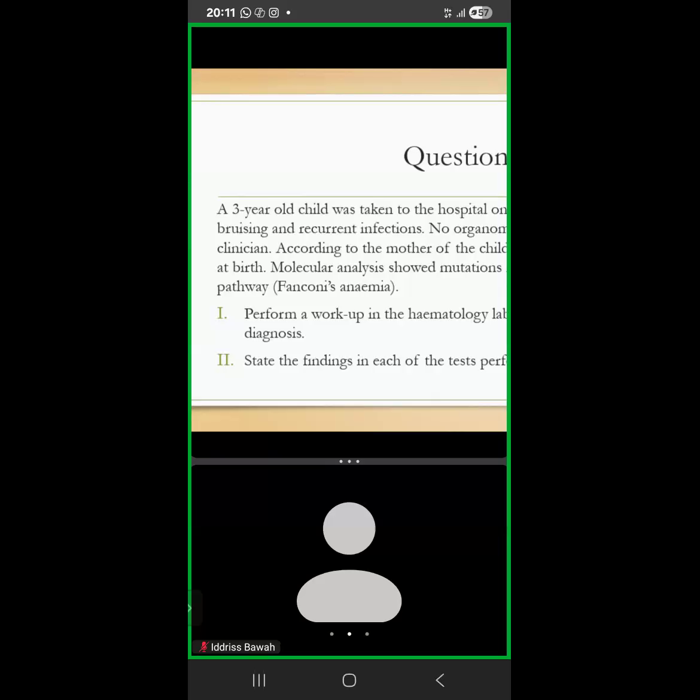It is only when you begin to examine a smear and go to cytogenetics, then you can conclude and say that because we have that and that, then that's how it is. Otherwise, all we do is describe cells and platelets, and then there'll be nothing else to write.